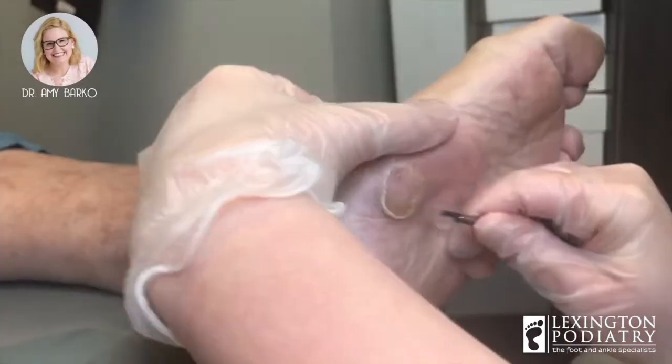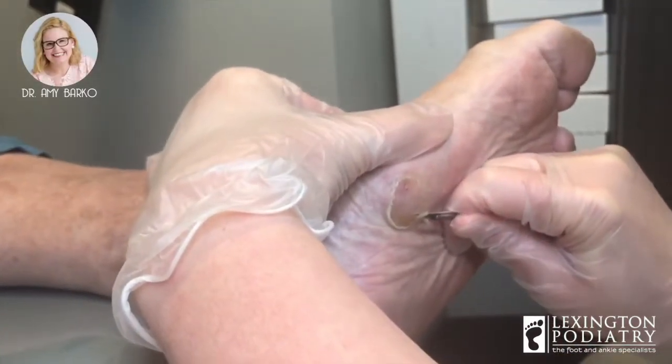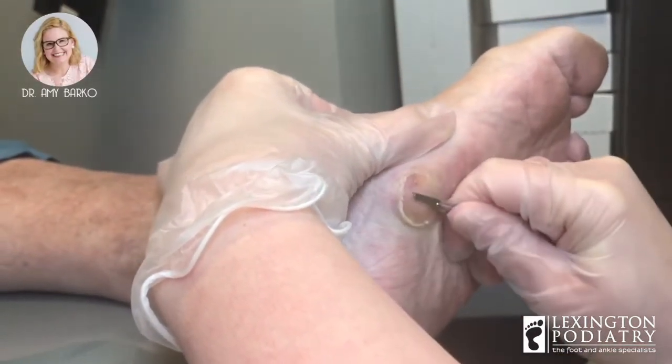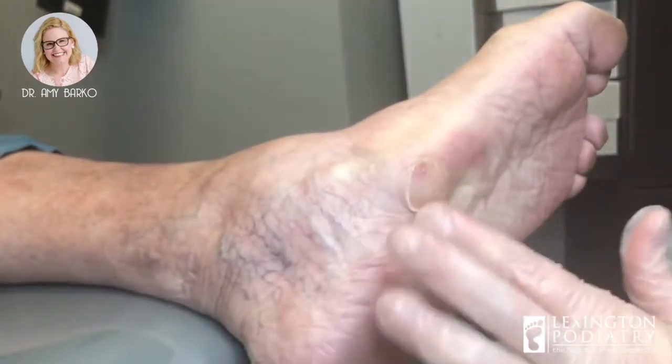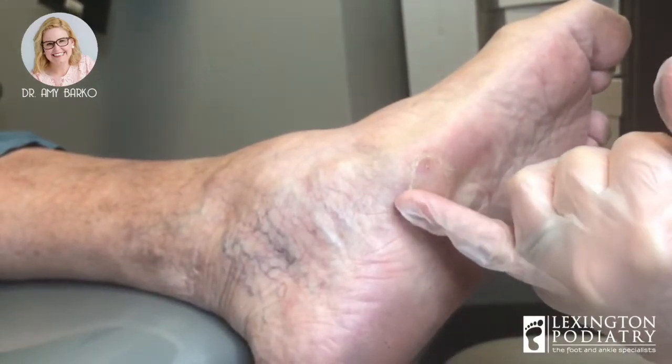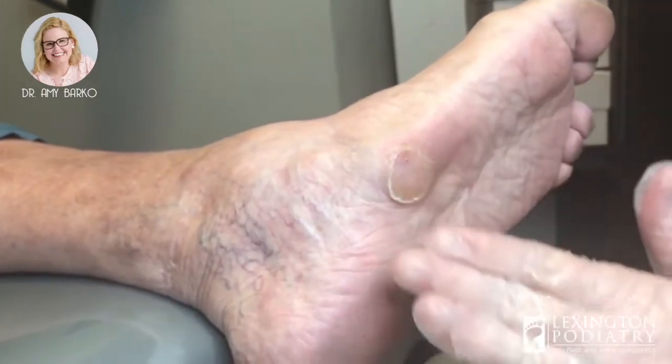Okay, we are trimming a callus. We've done part of it here. So you don't want to trim, I mean, it just depends. We also use a Dremel afterwards. So see how we've got a little bit of an edge here? We're going to smooth that out with the Dremel.